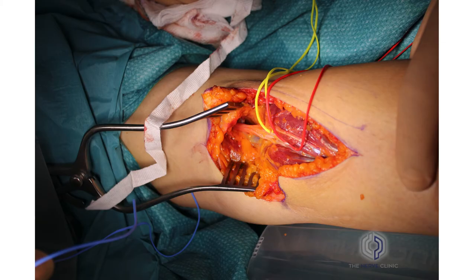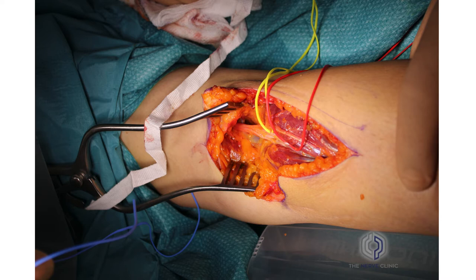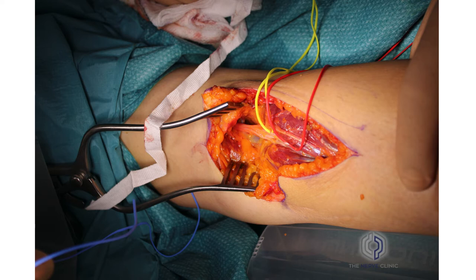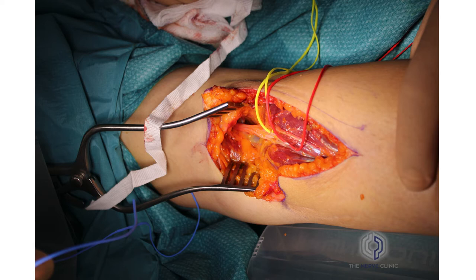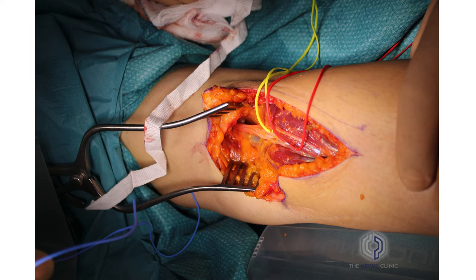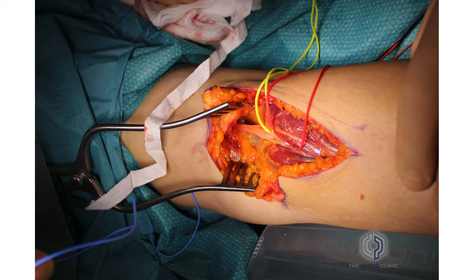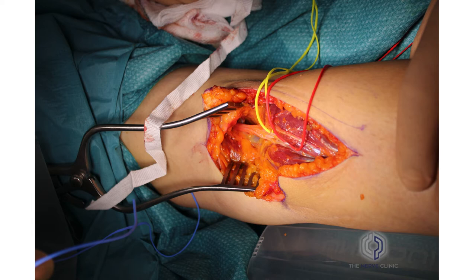This case is looking at the tibial nerve and its branches. The leg is visualised with the hip to the left-hand side and the foot to the right. The tibial nerve is entering the calf and at this point there are numerous branches to the key muscles in the upper part of the calf. These include a combined pedicle to the lateral head of the gastrocnemius, a branch to the soleus, and a further separate branch that goes to the medial head of the gastrocnemius, seen in blue.